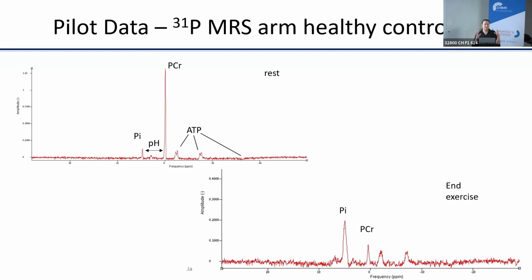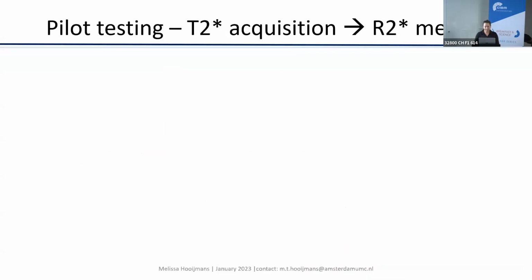And also to keep in mind, when you position in the MR scanner, ideally you want the region of interest you're imaging in the middle of the tunnel. That's of course not the case because the arm is always on the outside of the body. So we try to move the participants slightly to one side to have the arm we're imaging more in the middle of the tunnel. But of course, it's always still more on the outside.